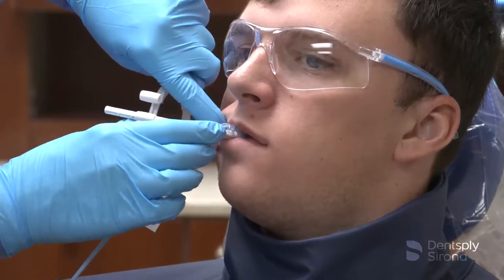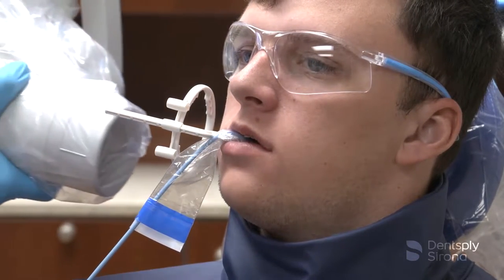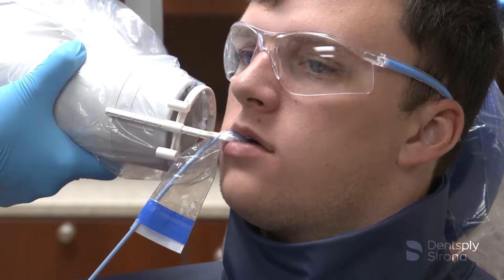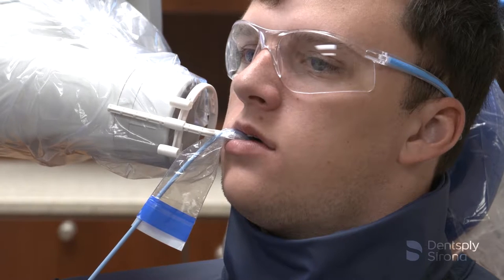Once the bite block is in place, slide the aiming ring down the arm close to the patient's face. Align the tube head of the x-ray unit in a close approximation to the aiming ring and center it. The x-ray image is now ready to be captured.